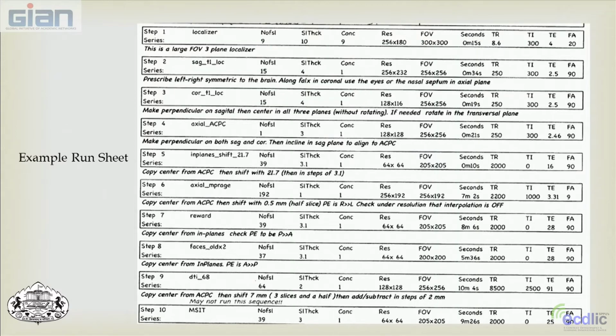So a run sheet for our study may look something like this. This is the information that we would give to the MRI tech, or the information they would be looking at while they're running our scans. So when we do human subject studies, we have a radiologist technician who actually runs the machine, and usually then there's somebody from the lab who is talking to the participant, telling them what's going to be coming, and running basically the functional tasks as the scan is going on.